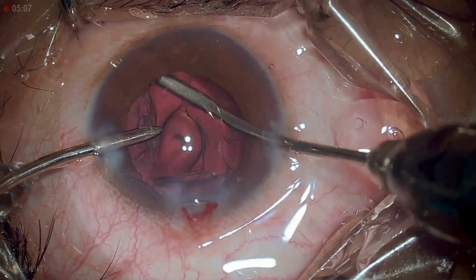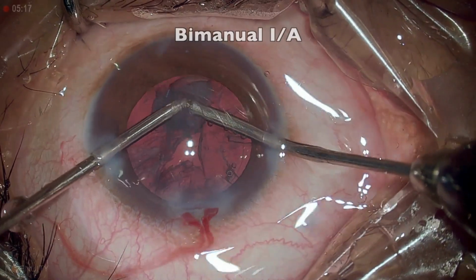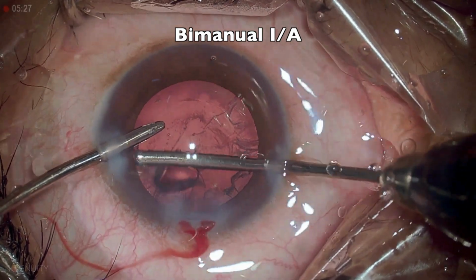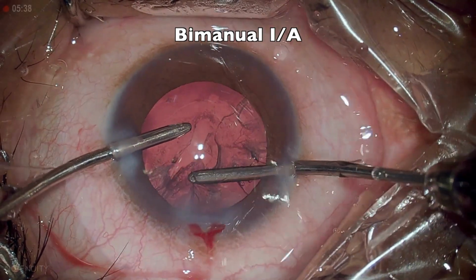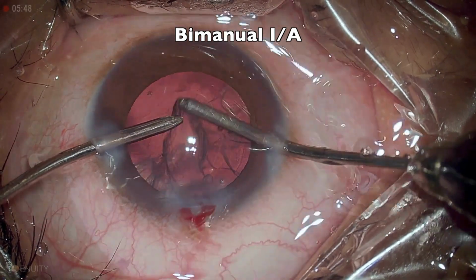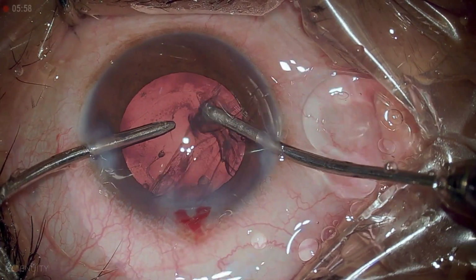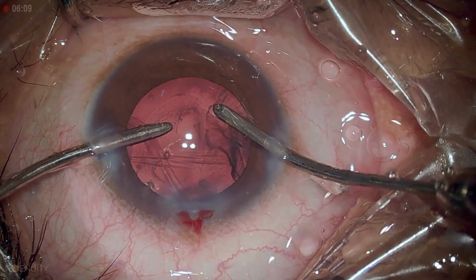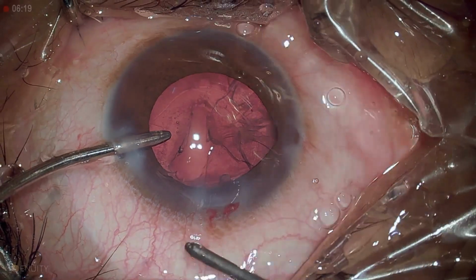The rent, for some reason, does not extend, and it remains at that because probably it could be an inadvertent lens touch by the retinal surgeon, which has made that area a deficient or weak area which ruptured during the hydrodissection. But interestingly, the edges were a bit strong, so they did not tear off and run into the periphery.